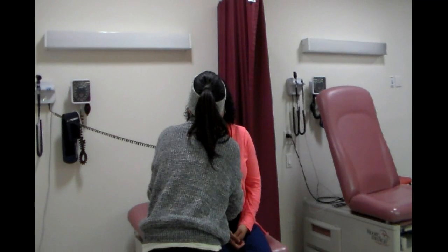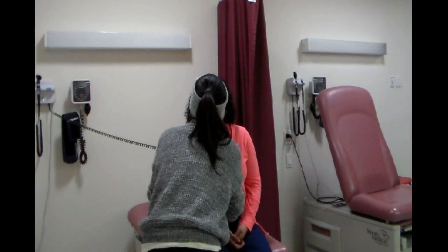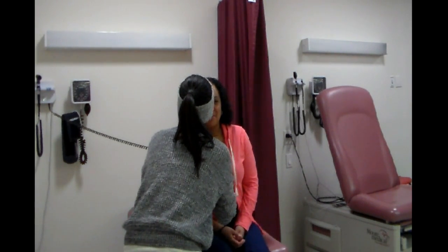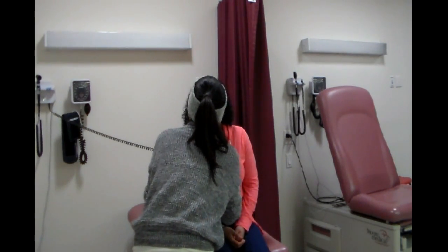And I'm looking at the nerve in the eye. The optic disc looks pink. I didn't see any AV nicking.